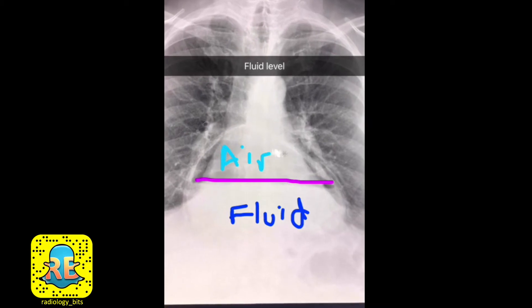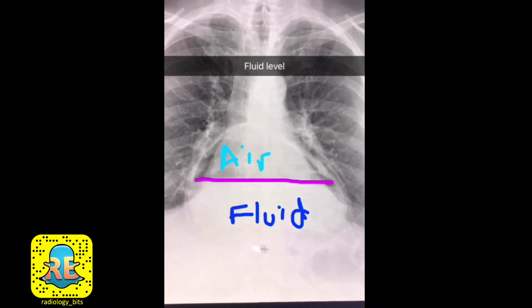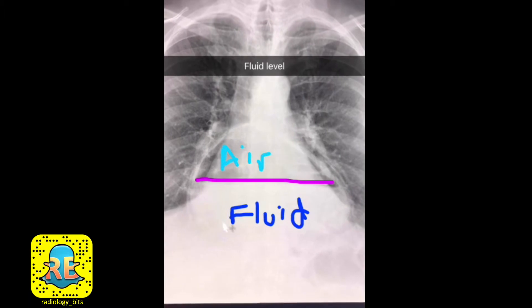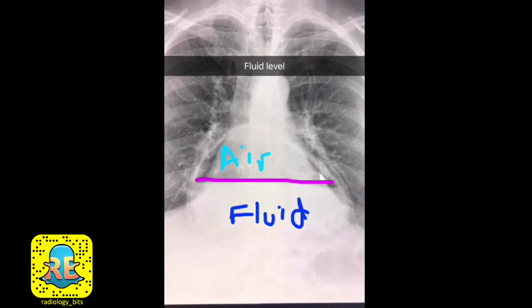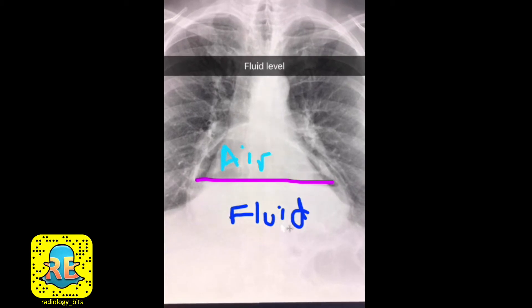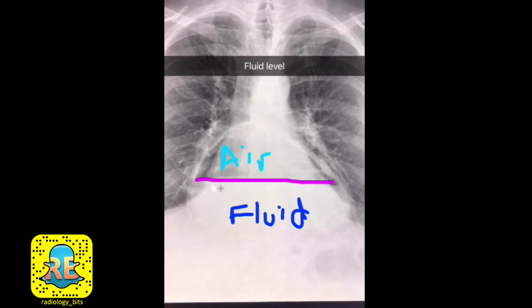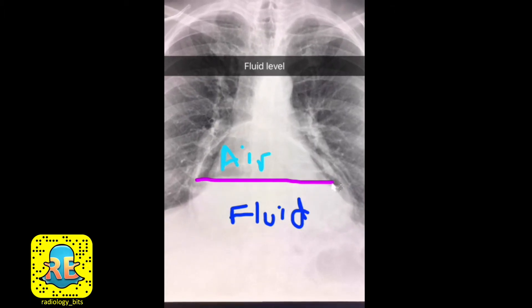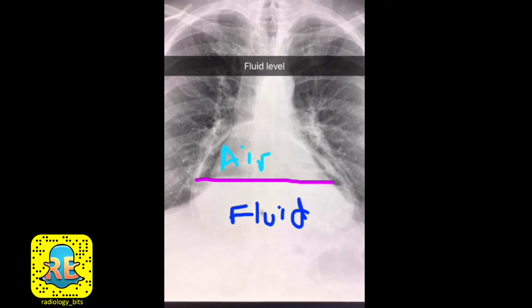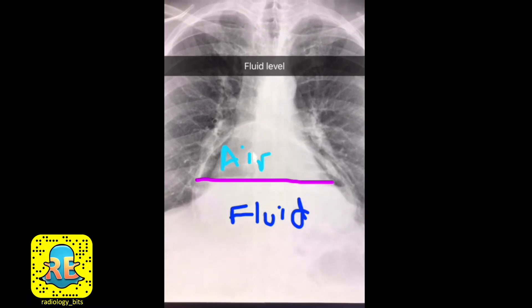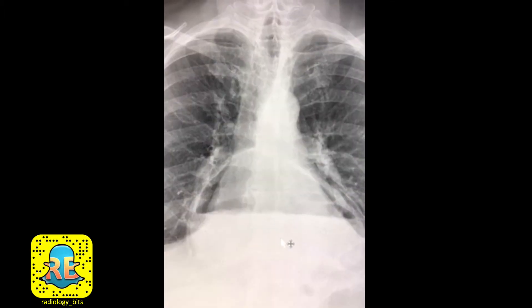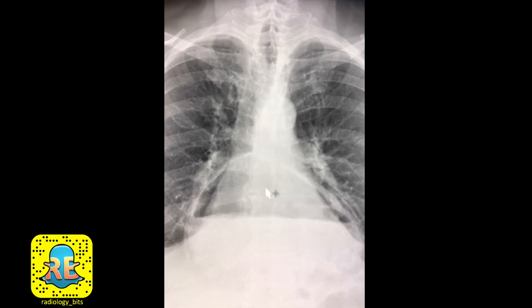Back to the abnormal case — you notice different densities projecting over the expected cardiac location. You have air density similar to what you see in the lungs, and this is seen centrally. You also have soft tissue or fluid density — the white area — and there is a straight line in between. Whenever you see a straight line, that means the space contains air and fluid, which is why this is called a fluid level or air-fluid level.